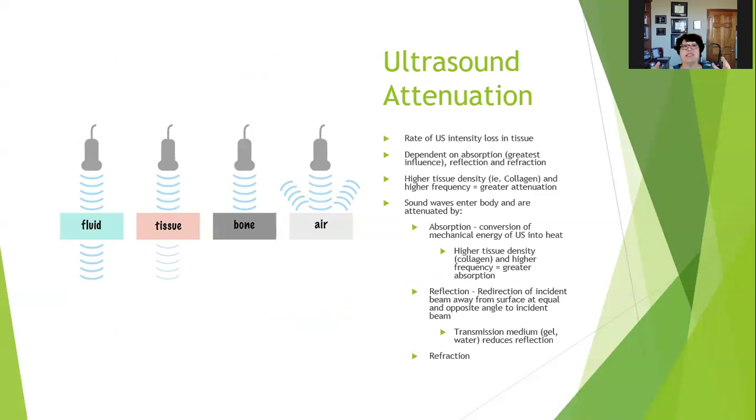Ultrasound attenuates, which means it gets less. Just like sound, any sound waves, regular audible sound, attenuates as it goes out. So if I go out in my front yard and I yell, the neighbor across the street's probably going to hear me. Maybe 2 houses down, they might hear a little bit, and then 3 houses down, they're not going to hear anything. So sound attenuates and ultrasound attenuates the same way.